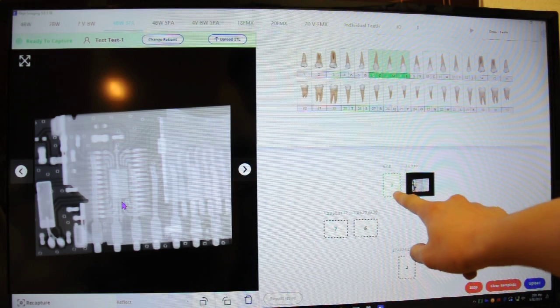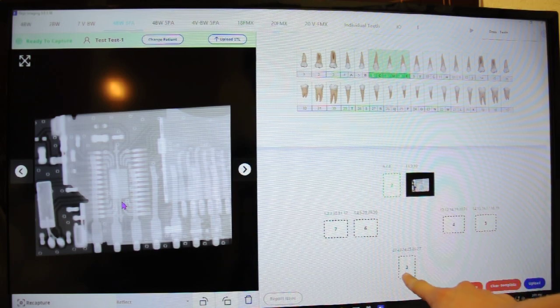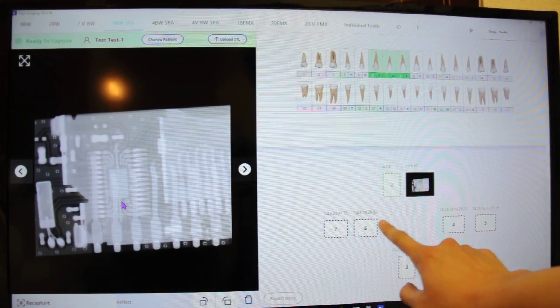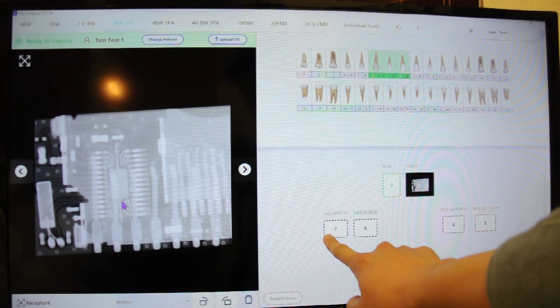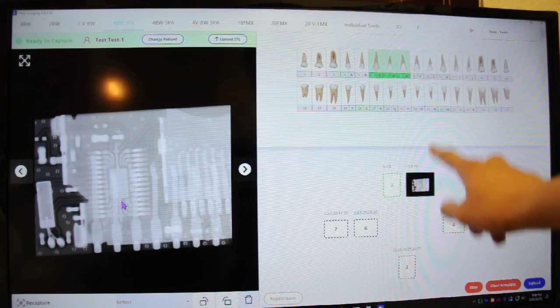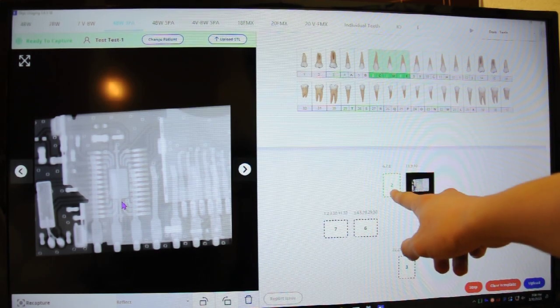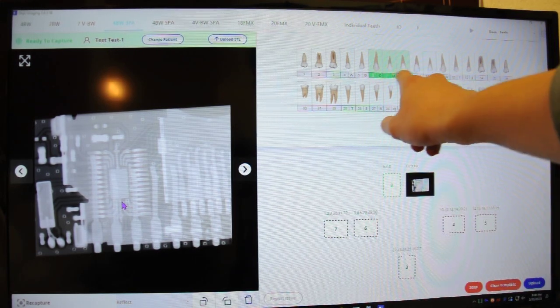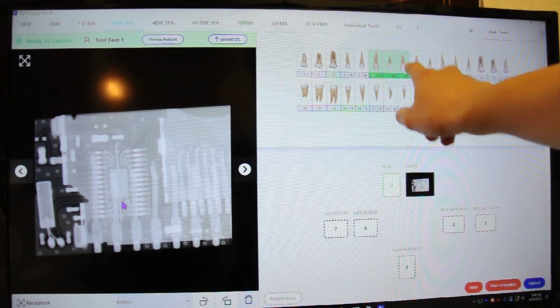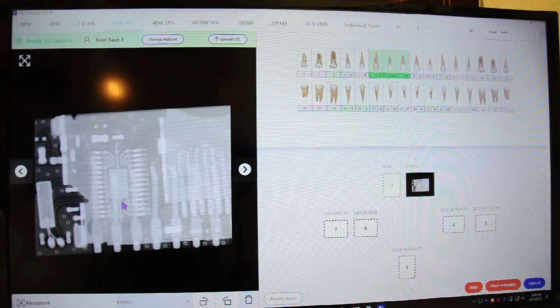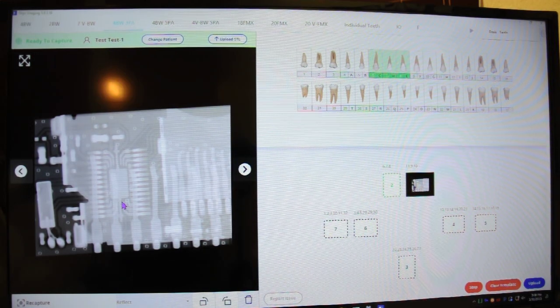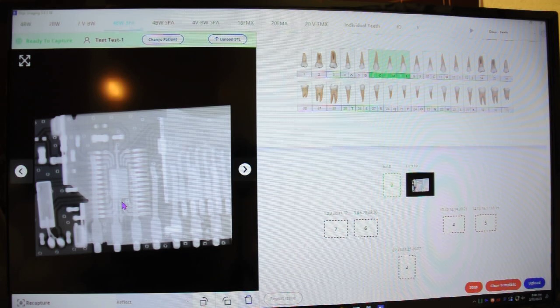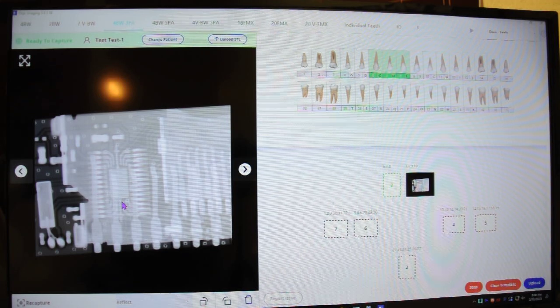You see it kind of goes in order. It tells you one, two, three, four, five, six, and seven. So I just took the first one. It automatically skips to number two. So that's going to be taking six, seven, and eight in that region. Capturing the x-ray. Good.